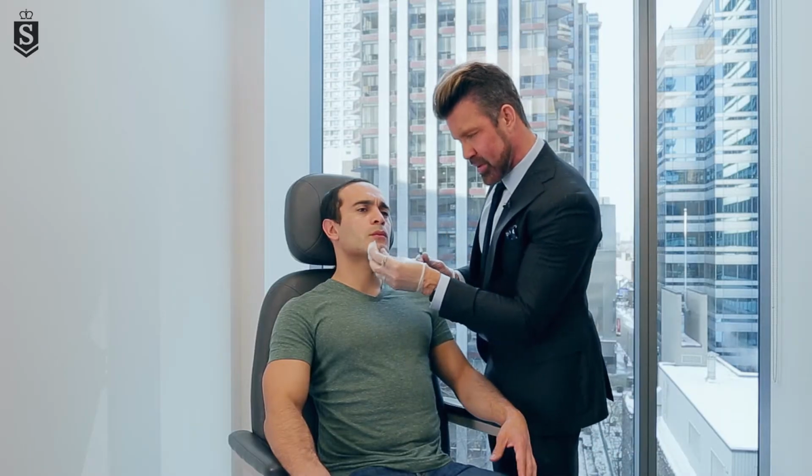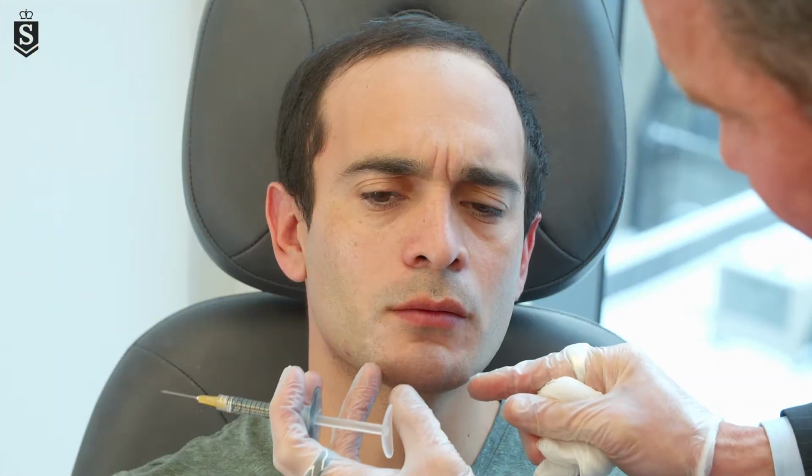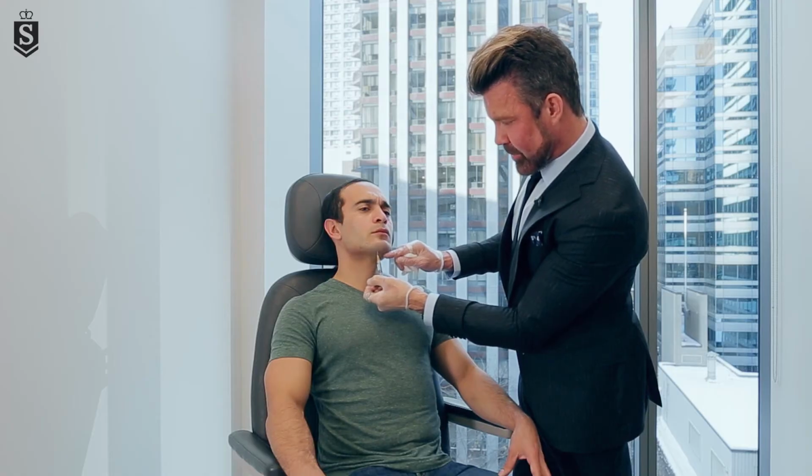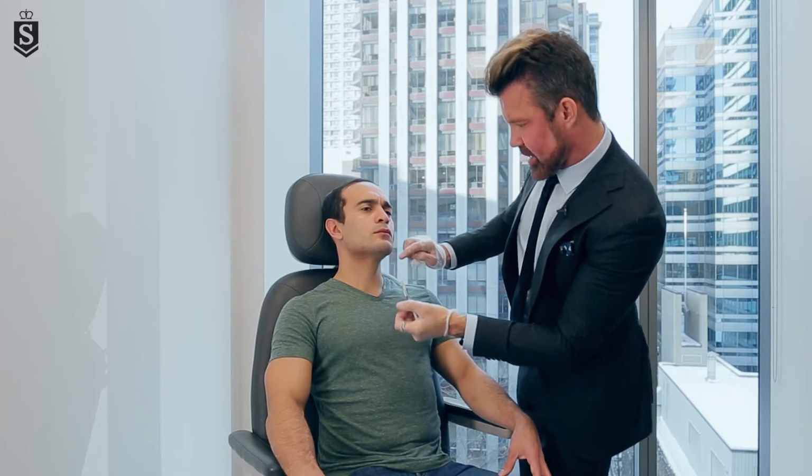And as we go, the numbness will probably last for about 10 minutes. So I'm really deep right now in the deep fat compartments right on top of the bone, and you can see how that instantly gave a little bit of punch here. We're gonna do a little bit more product as well. We'd like to see the chin sort of be as wide as the corner of his mouth. So we're going to do a little bit more laterally to be able to create that effect. He's got a little bit of retraction and depression here, so we want to correct for that. It's a very powerful product, and you can see how instantly that has corrected for that. So again, I'm very deep.